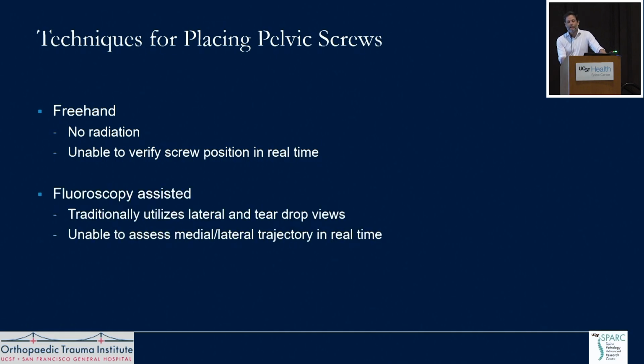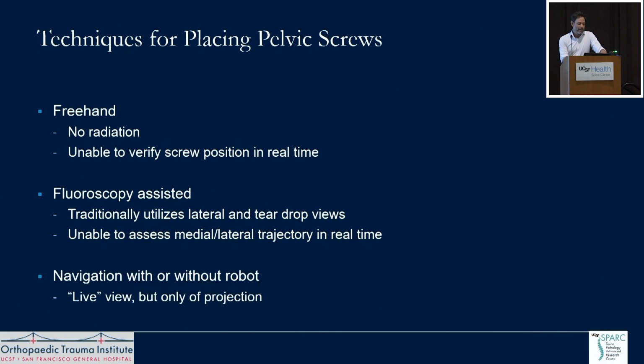There's fluoroscopy. A lot of times we'll utilize a teardrop. And as I'll show, the teardrop is a hard view to work under because it's in the way. And then, of course, there's navigation, with or without assistance.